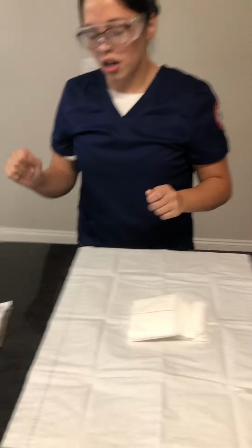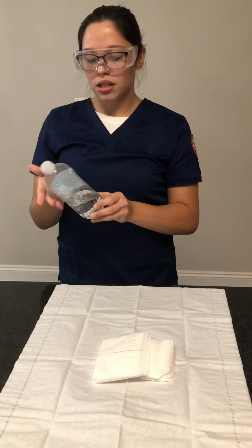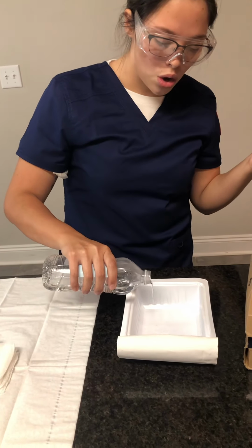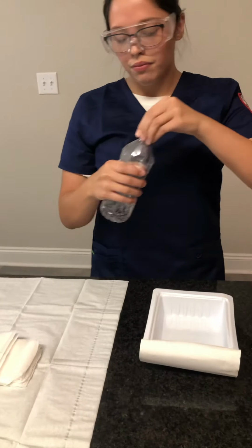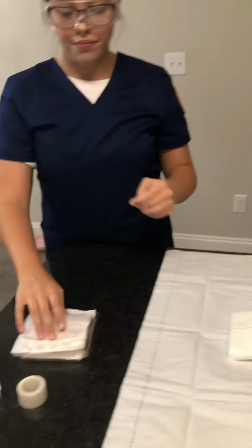I will then grab my saline bottle and check the expiration date, and then I will palm the saline label, taking the lid off, facing it upward while pouring the saline in without splashing or touching the edge of the tray. I will then put on my sterile gloves.